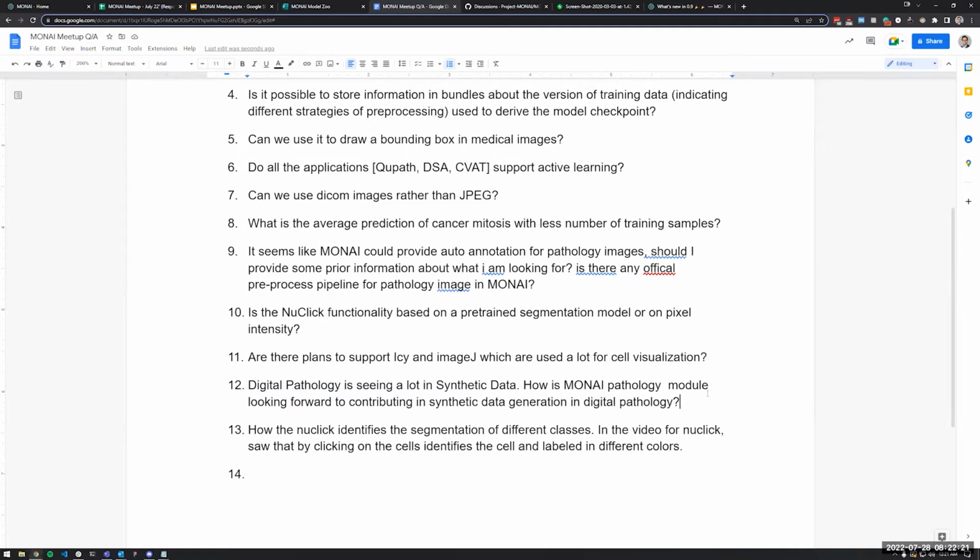Well, synthetic data, a lot of what we've been doing has been augmentation. So that's kind of synthetic data in a sense. We modify images a lot during training. We have some synthetic data just for doing testing on, really. That's mainly what we've been doing. But for doing actual generation of data that's supposed to represent actual CT or MR, for example, that's been other areas of research we haven't really gotten into terribly much.